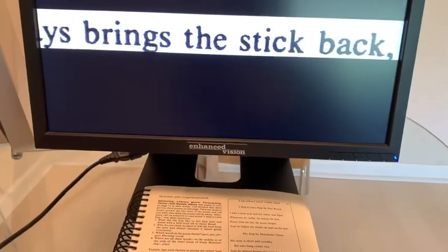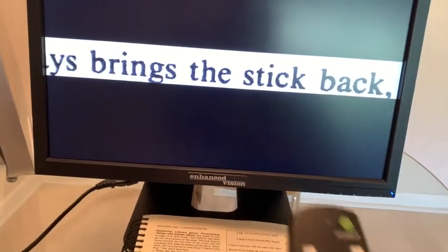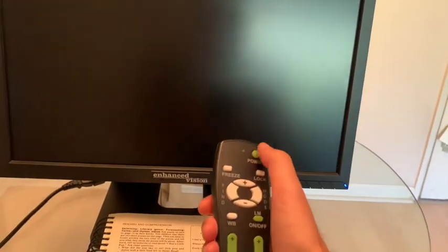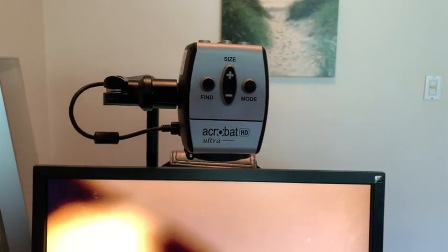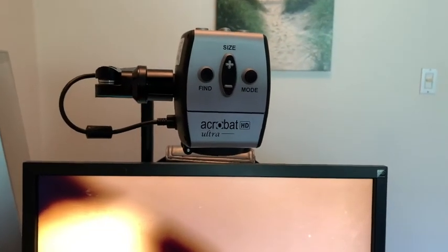You can keep the power switch on in the back and just turn it off with the remote. This arm is pretty adjustable, and if you want to try some distance viewing, you'll have to extend the arm a little bit more.